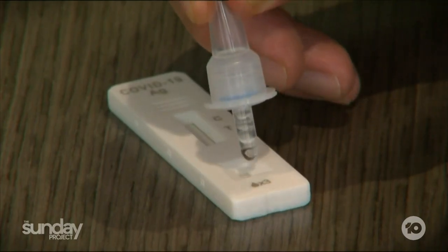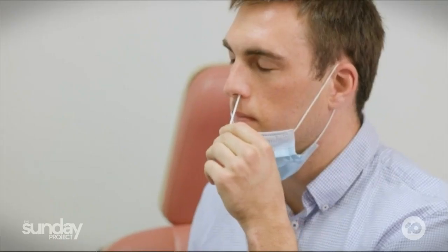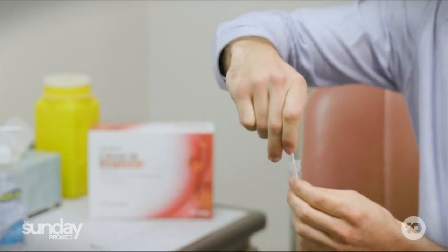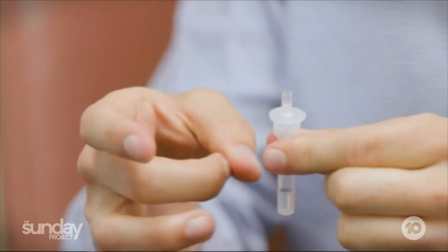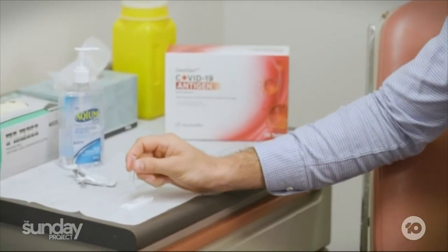Well, the basic answer is we don't know. We assume that these tests are done and validated by scientists in a lab. But here we are asking millions of Australians to do these tests themselves. So we don't really have populational data on how good this testing is, but it is still a good test. Hopefully improving your technique will also improve the experience and improve the capture rate.